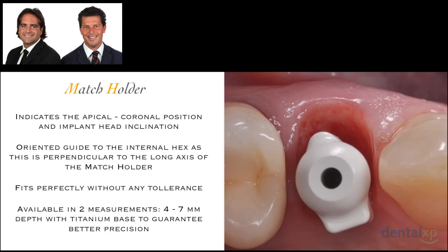Here you can see in the picture on the right the match holder in position, and you can see that we did not have any shrinkage, we did not have any collapse bucco-lingually speaking, and also how the overbuilding is still in place. And this is what we want to see when we are approaching our impression, which can be traditional or digital, that doesn't matter, but what you want to see is that clinical scenario.